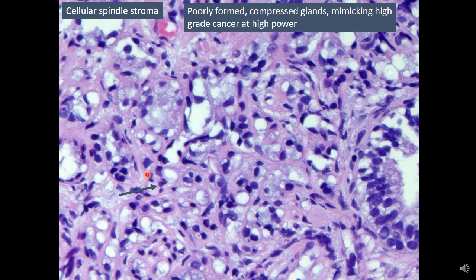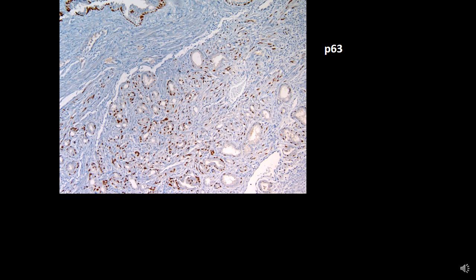The stroma surrounding these glands also has a hyalinized appearance. Note that if you miss the low power appearance and jump directly to high power magnification, this lesion can be very easily misclassified as prostate adenocarcinoma grade group 4 or 5, because you have numerous poorly formed glands, compressed glands, signet ring cell type cells, blue mucin, and even single cells. So this is a great mimicker of high grade prostate cancer.